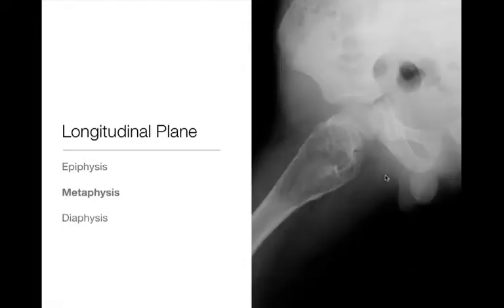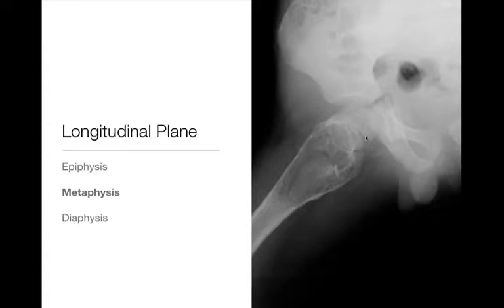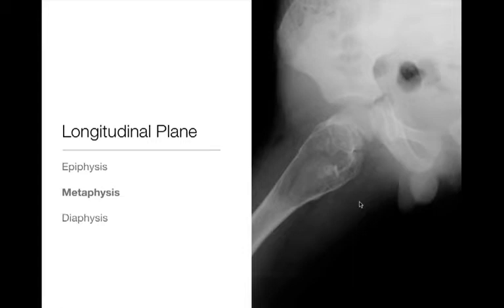Next up is the metaphysis. Here we have a geographic lytic lesion with a non-sclerotic border and narrow zone of transition, centered in the metaphysis and somewhat into the diaphysis of the proximal femur. This is a child, so we have a clear epiphysis, unfused growth plate, and the metaphyseal lesion itself. Note it has a fracture through it — here's the pathological fracture and the fragment — creating the fallen fragment sign, which is classic and pathognomonic for a unicameral or solitary bone cyst. These tend to be metaphyseal or diaphyseal-based lesions centered in long bones.